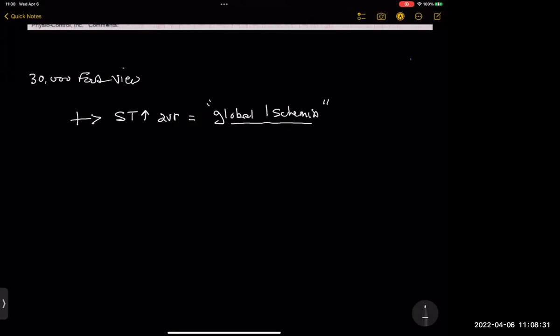And one of the major things that we see is disease of the left main coronary artery. So left main coronary artery disease may present with ST elevation in AVR. That is to say that there are large areas of ischemia going on. All right. And that's what I want you to think about there.